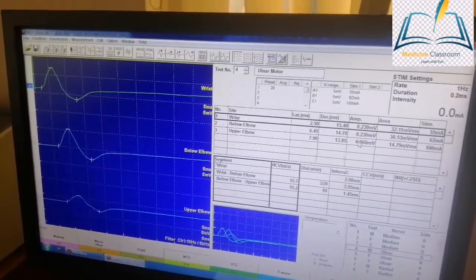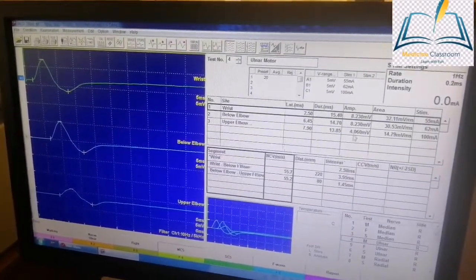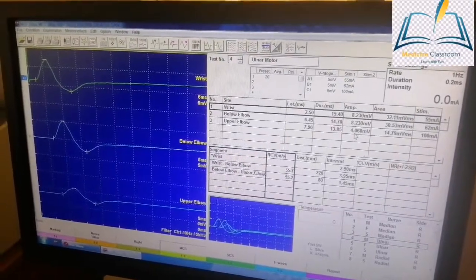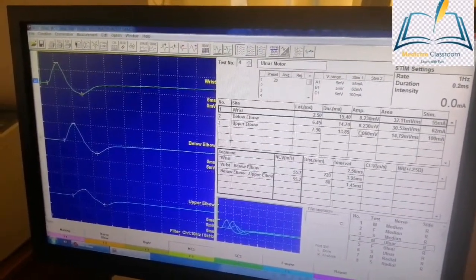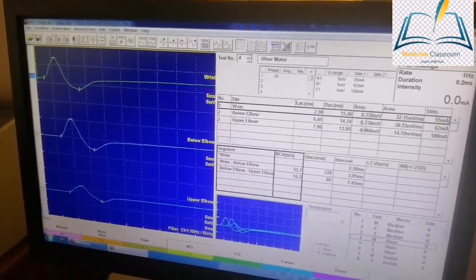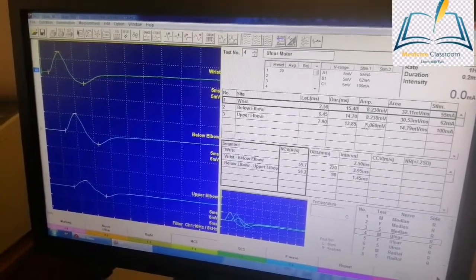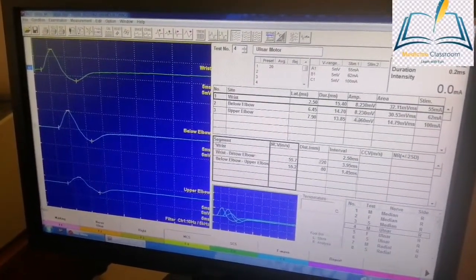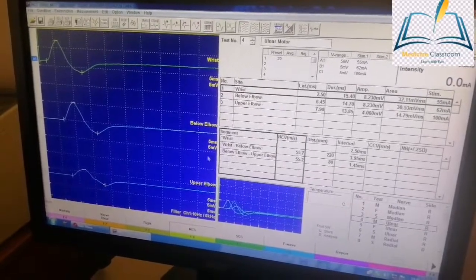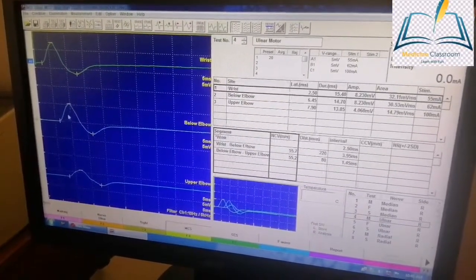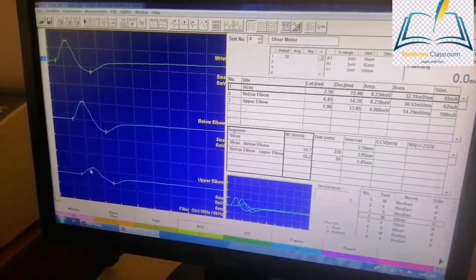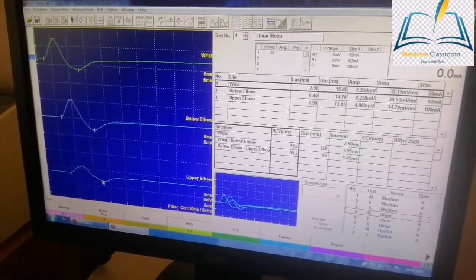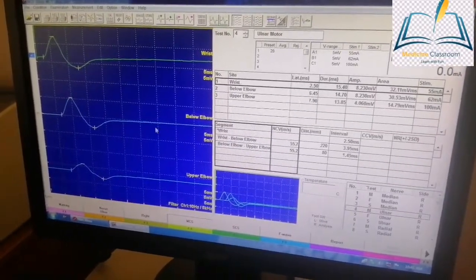Normally there should not be any drop. If the drop is more than 50 percent, then this is a confirmed conduction block. If it is more than 30 percent, it is possible conduction block. Here, if you take out the ratio 8 by 4, there is a drop by nearly 50 percent. So there is a conduction block. You can see even in the graph that there is a drop in this amplitude.